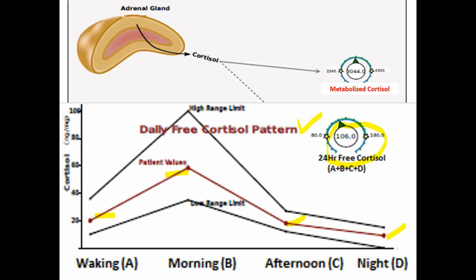Overall, the levels here of free cortisol are not low. They're either normal or elevated in this particular case. The patient noted taking glucocorticoids, so it's odd to see cortisol levels that aren't low with glucocorticoids, which would typically imply that the glucocorticoid is not at a sufficient dose to suppress cortisol.